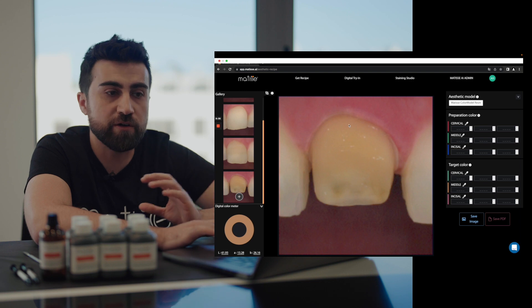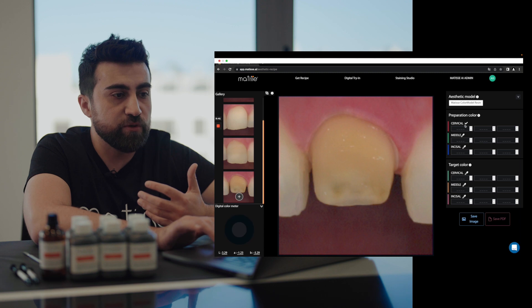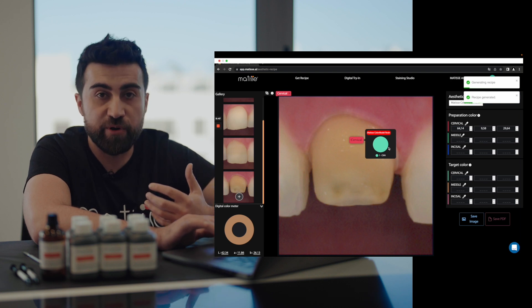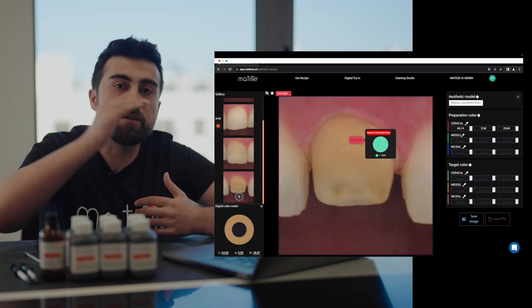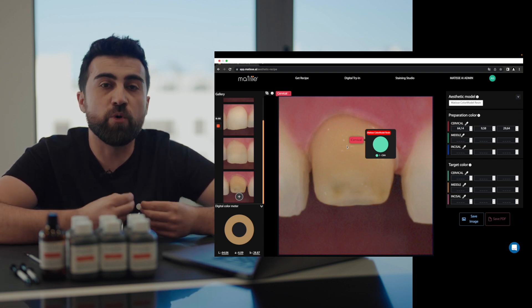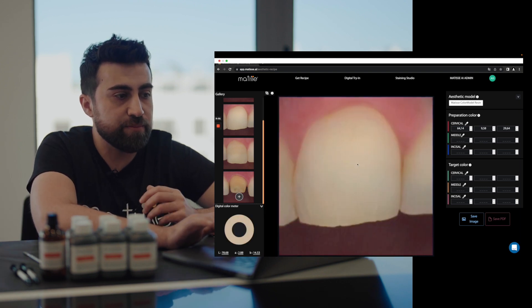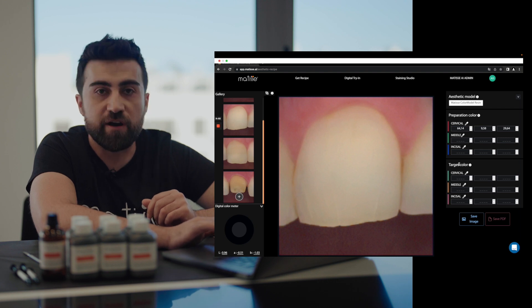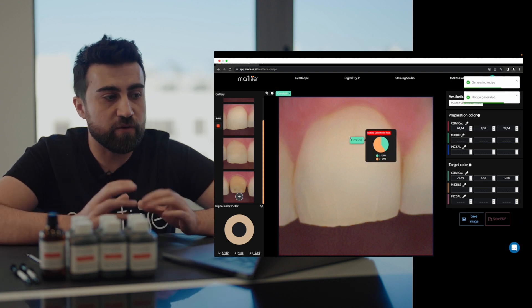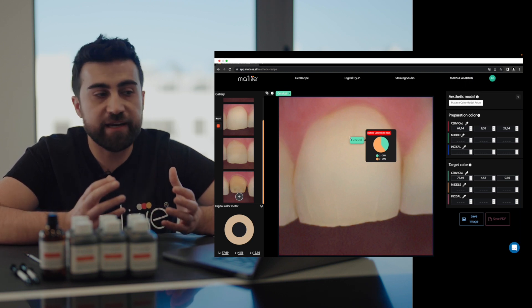If the preparation is one color you can use only one color picker. For example, you click on the color picker, measure cervically, and use that recipe to replicate the preparation color. If you see different zones, you can use three color pickers to make your aesthetic model more precise. To fabricate the neighbor teeth, you can measure the target color — just generate one recipe, because that's more than enough for your aesthetic model.